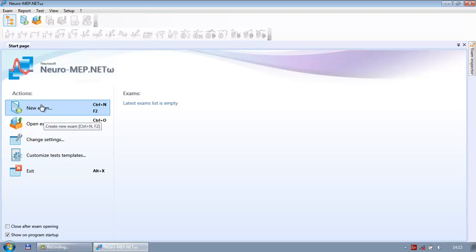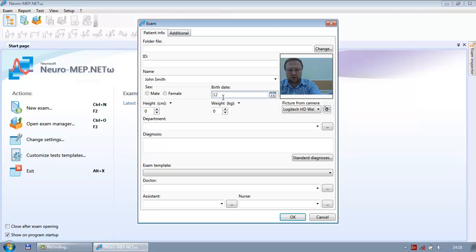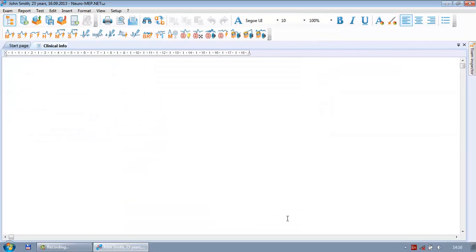The first thing you should do is start your exam. Press the 'New Exam' button and the patient new exam window appears. Enter the patient name — for example, enter the patient details along with height, weight, and so on. You can keep these defaults and just press OK. The software then allows you to enter information about why the patient came to your office, and you can enter that here.